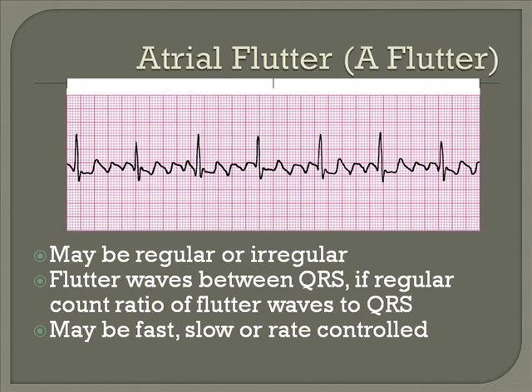I don't want you to focus so much on differentiating between atrial flutter and atrial fib. The main thing you need to focus on is the rate controlled. If it's irregular and you're not sure if the waves in between are flutter waves or fib waves, then as long as their heart rate's controlled, that's a question for a cardiologist and an outpatient doctor. So in the hospital, they're most likely going to come in with a fast rate, and our focus is going to be on controlling that rate so their ventricles have an adequate amount of time to fill.